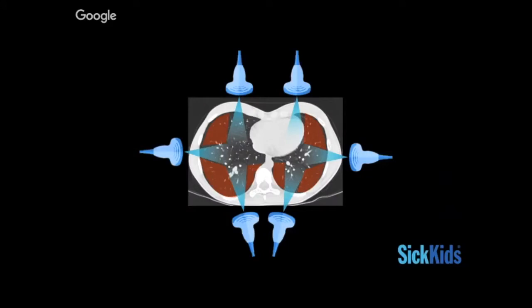Keep in mind that despite lung ultrasound being a good screening exam, it's about 95% sensitive for consolidation compared to lung CT. But there are areas highlighted in red here that you may not be able to cover. But usually if it's in those zones, it may arguably be small enough that it may not be clinically relevant.